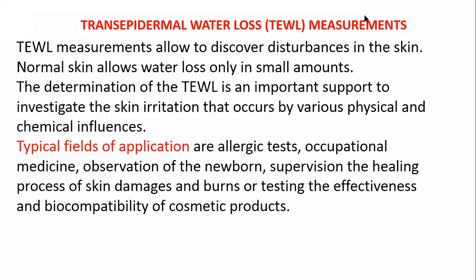Another measurement is called TEWL — transepidermal water loss — which calculates how much water is lost from the skin. The TEWL measurement allows discovery of disturbances in the skin; normal skin allows water loss only in small amounts. However, sometimes the skin may lose a maximum amount of water due to any kind of skin problem. The determination of transepidermal water loss is an important support to the investigation of the skin — in cases of irritation, allergic conditions, or chemical influences. If the water loss is more, we can be assured that there is a problem with the skin.